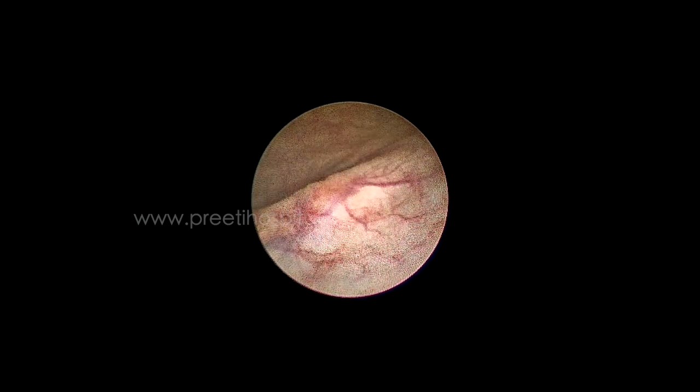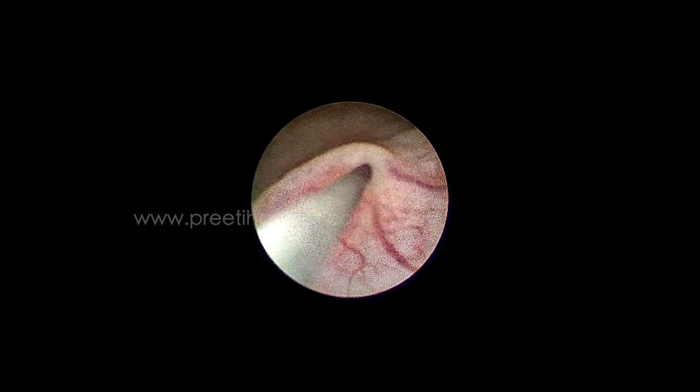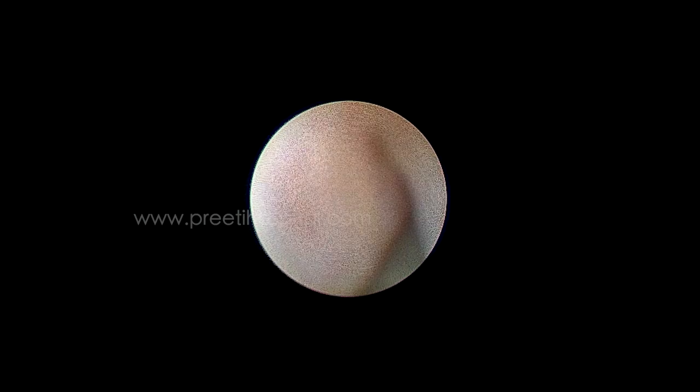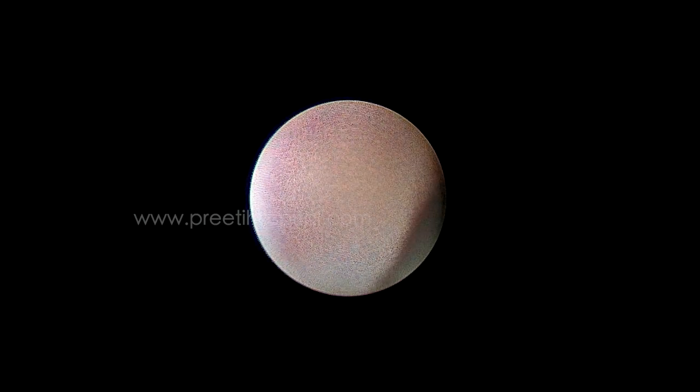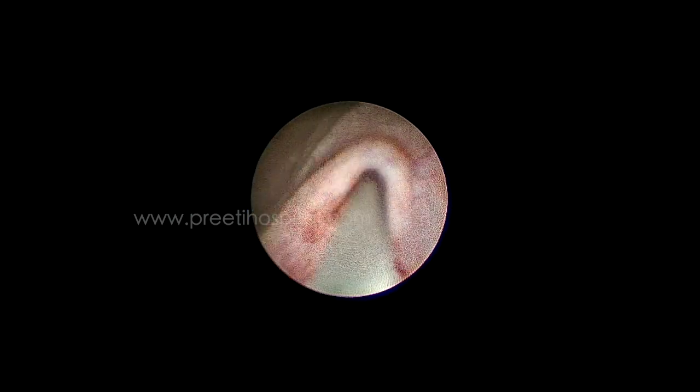Now I am passing the guide wire. When you pass the guide wire, if the ureteric orifice is overly elevated like this, you can probably pass the ureteroscope. Now I am turning the ureteroscope 180 degrees to the opposite direction, like this, and then entering.